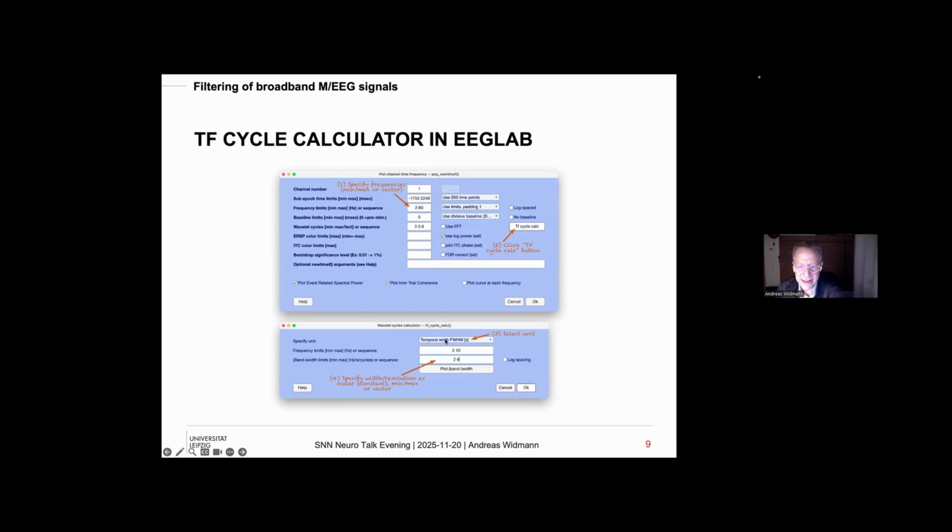First, you select your unit, and you have the same units I told you. You have full width at half max in frequency, so in hertz, or in the temporal domain in seconds, or you can have 2 sigma t or sigma t or cycles. But that is only useful if you want to recalculate papers with the GUI, where those cycles could directly enter the old interface, and do not want to use the command line interface.